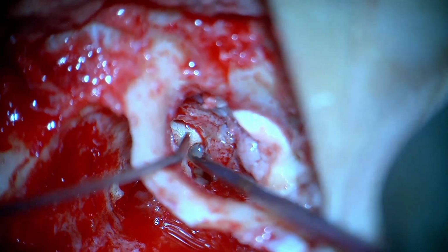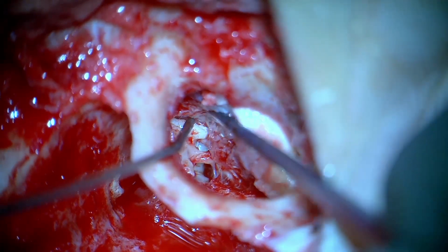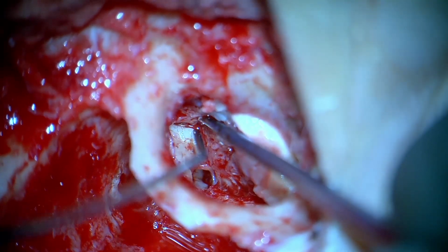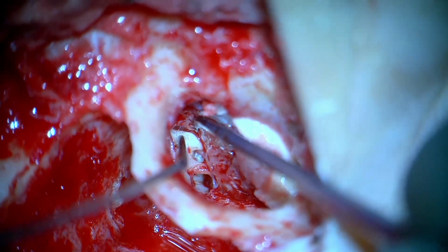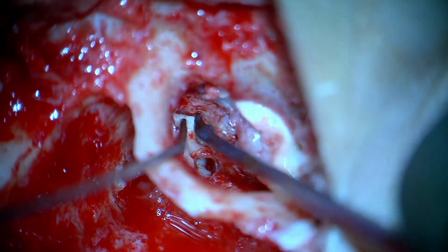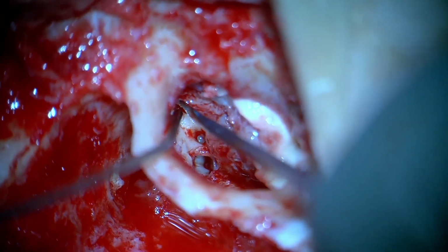Now see how this is the groove between the incus and malleus. You've already seen the incus short process, the body, the long process, and now this is the malleus head, over which we are removing the edematous or polypoidal mucosa that was covering.